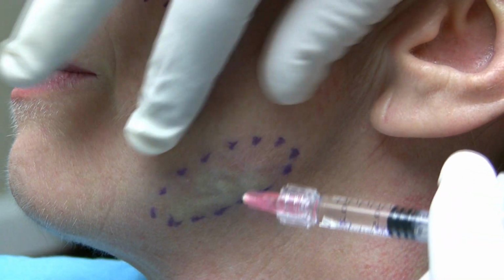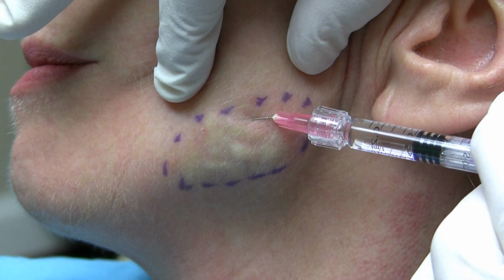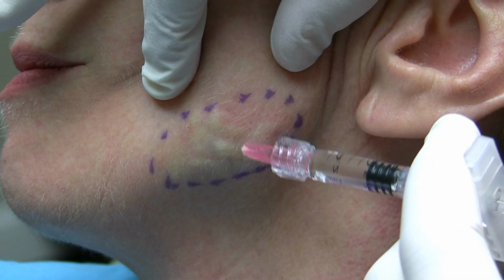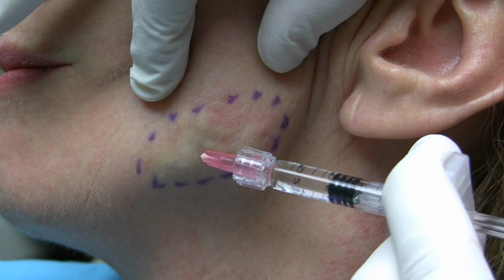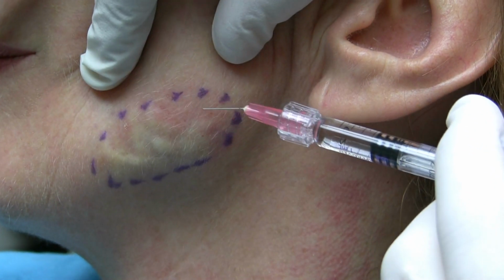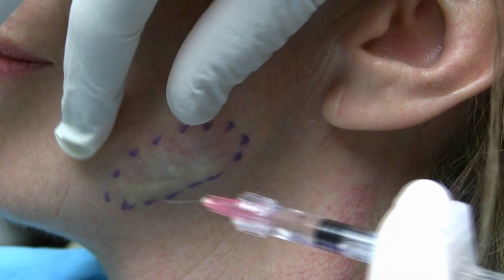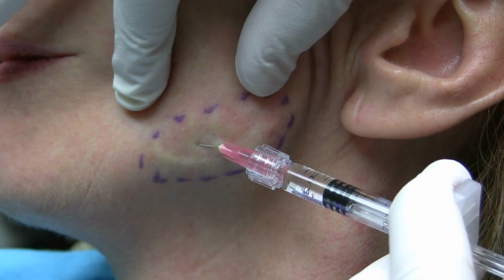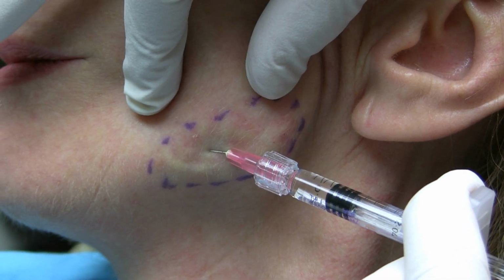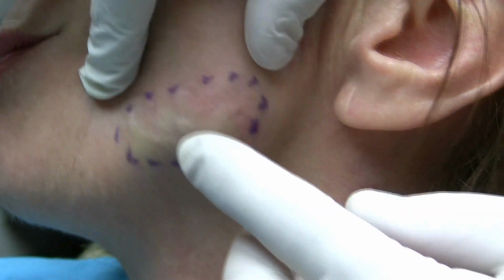So we're going to certainly layer this filler, and right now I am more in the subcutaneous plane, and it looks real bumpy to you right now for several reasons. One is that I'm putting the skin under tension, and I'm going to coalesce this with some massage in a second. And this is going to be sort of my basal layer.